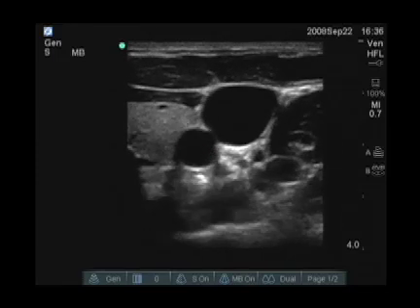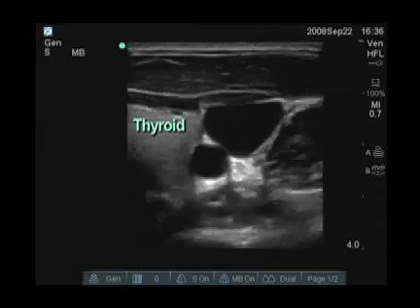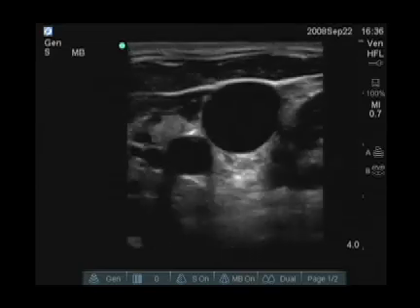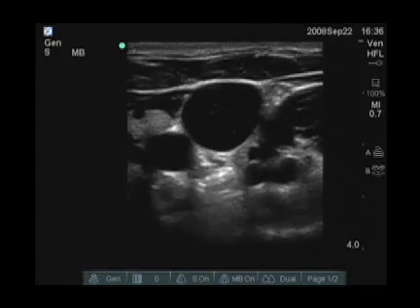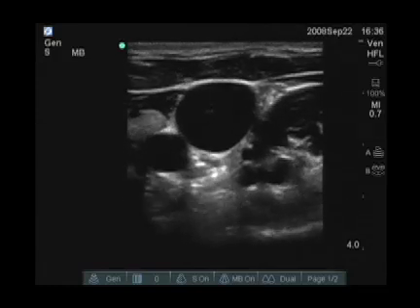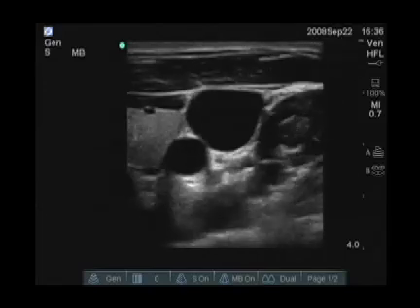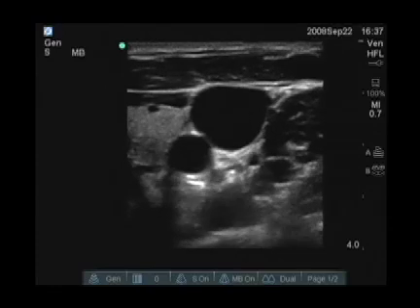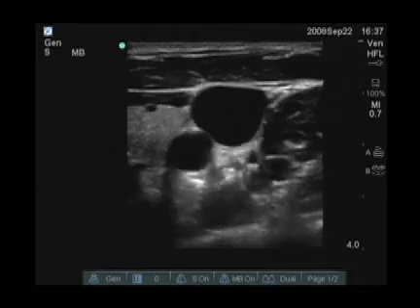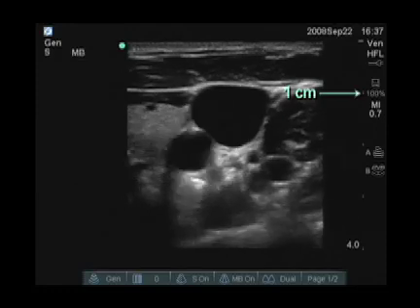The artery is what we want to avoid. Just a little bit more to the left of that is the thyroid. The ultrasound allows us to easily find the vein and track it along its entire course. First, we can identify whether the vein is patent — a patient who has had a previous cannulation may mean the vein is not a good candidate. Second, once we've identified the vein, we can map the skin and put marks on it. We can also look at the side of the ultrasound image to see how deep the vein is — in this case, it's about one centimeter deep.